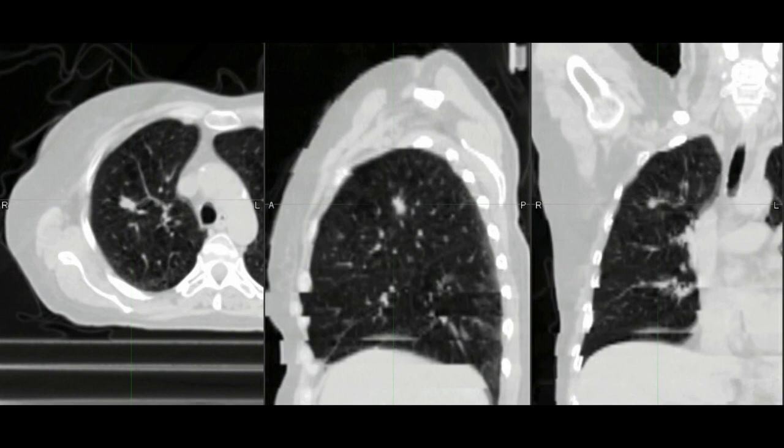You'll see here there's an artifact. You see the kind of strip of the diaphragm that shows up disconnected from the diaphragm. Those are sometimes seen in 4D CT. There are studies of these that are relatively common. It's something to be aware of. It's basically usually because of irregular breathing and catching things outside of the breathing cycle as normal. And there are not good ways to correct for that. And so it's something to be aware of.